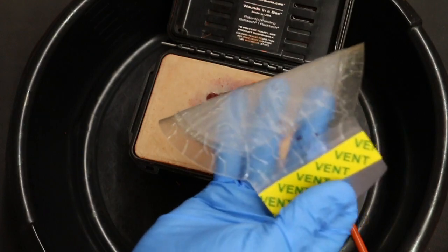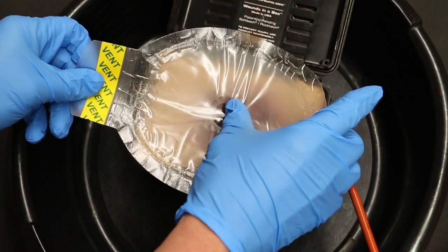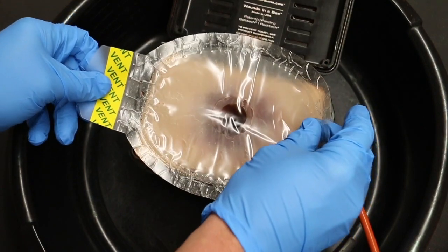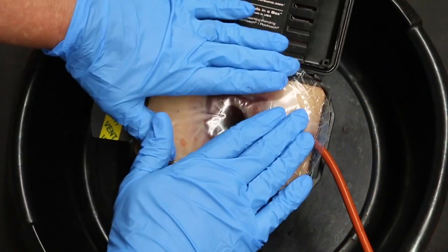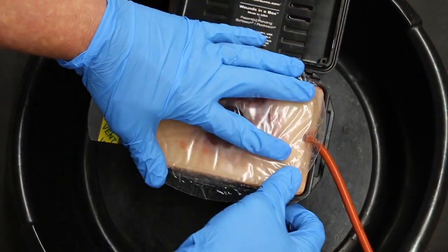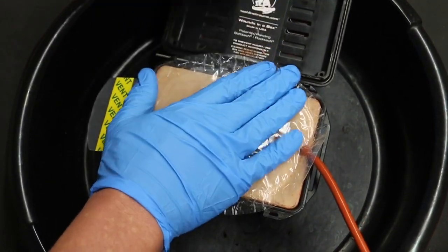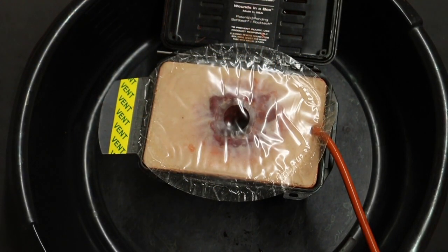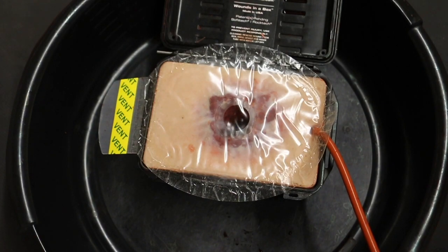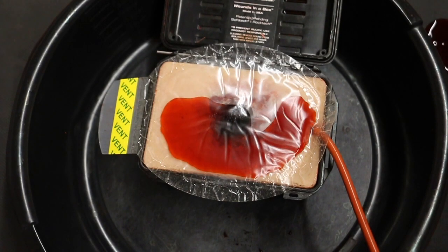So pull off the chest seal. Apply the chest seal with the hole of the vent over the hole of the injury. Make sure I get a good seal here so we can hopefully see the vents work properly. Alright, so let's see how this is going to work. Okay, you can see it's sealed up.